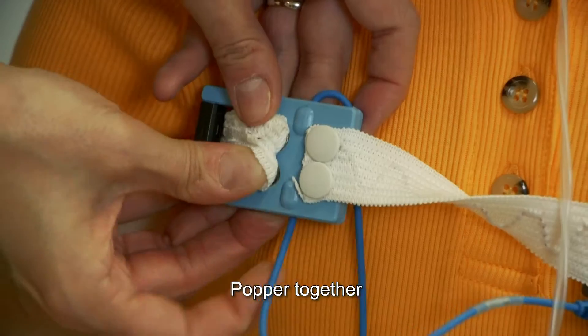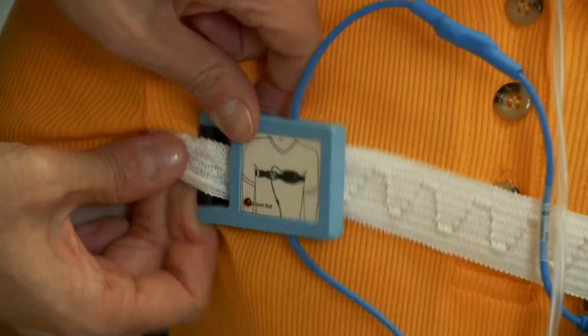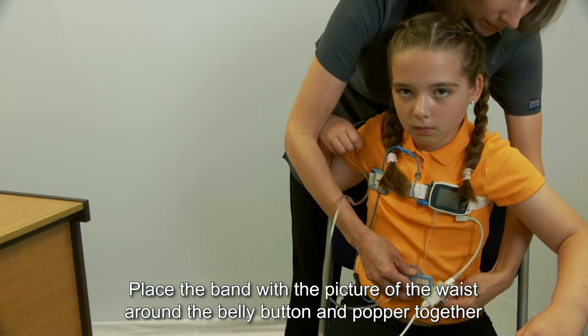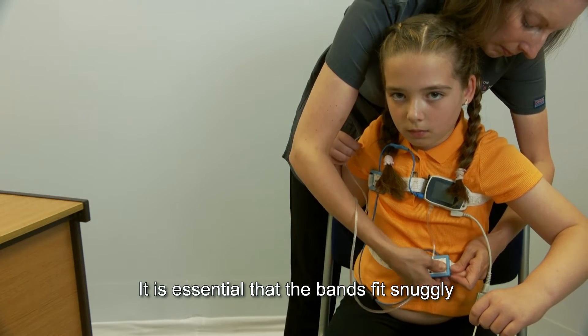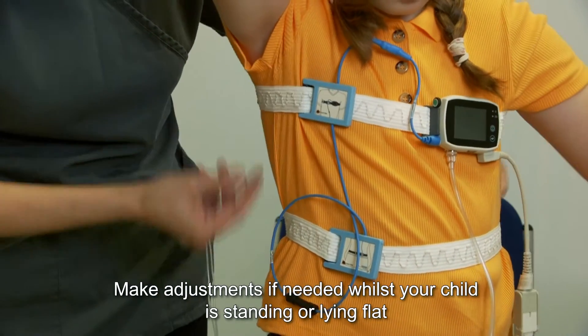Pop the chest band together. Then place the band with the picture of the waist around the belly button and pop it together. It is essential that the bands fit snugly; make adjustments if needed whilst your child is standing or lying flat.